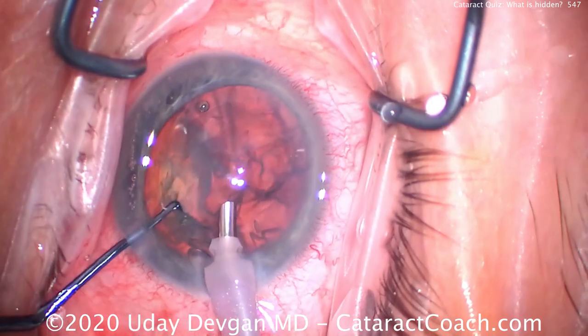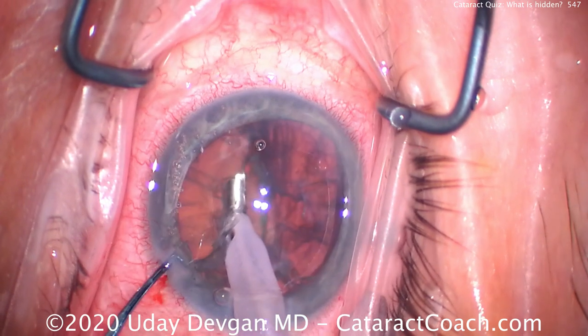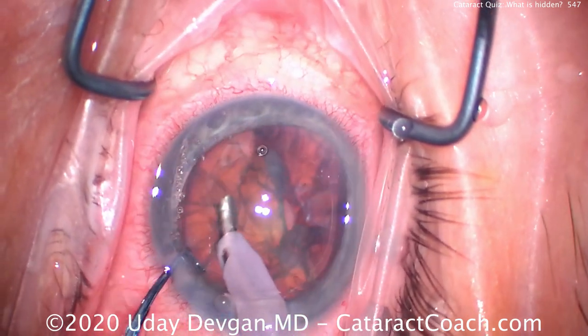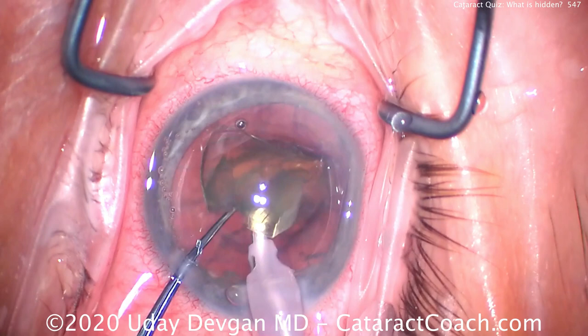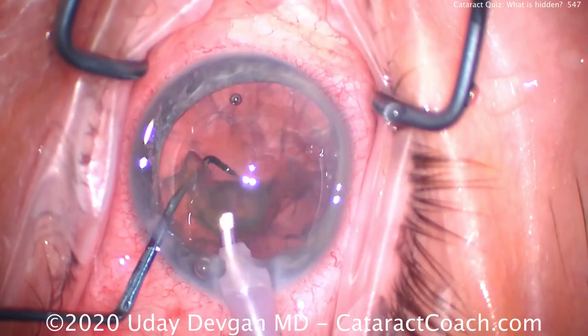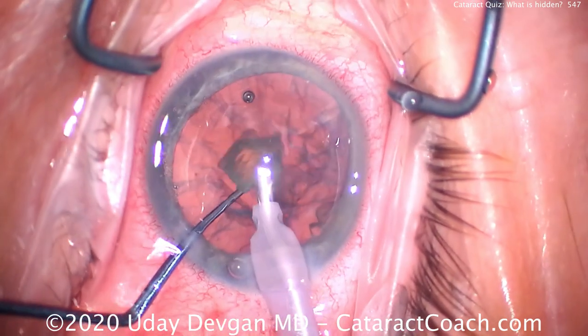So far so good, right? One half is out. Here's the second half — bringing it up nice and easy, teasing it up, trying to get it out of the capsular bag. Let's try again with vacuum. There it is — chopper goes around, chop a piece off. Emulsifying it nice and easy, taking out the last couple of pieces.